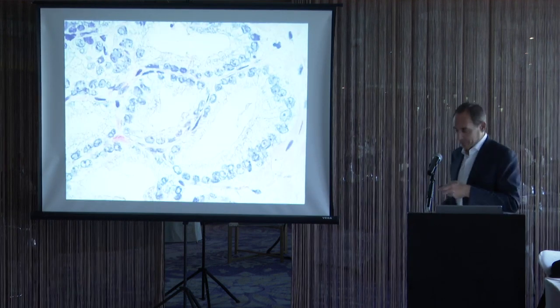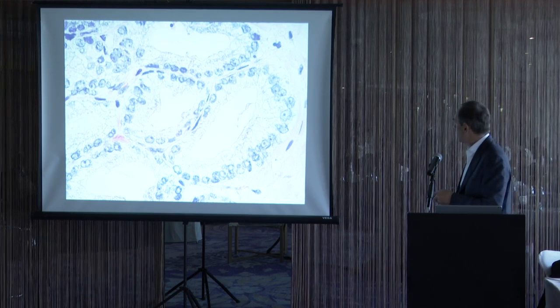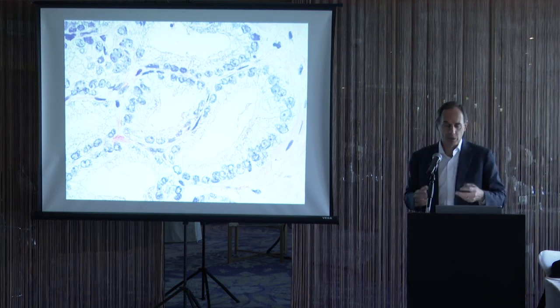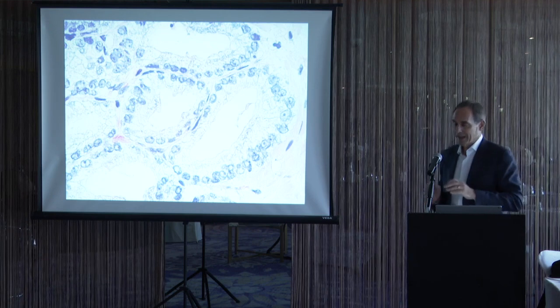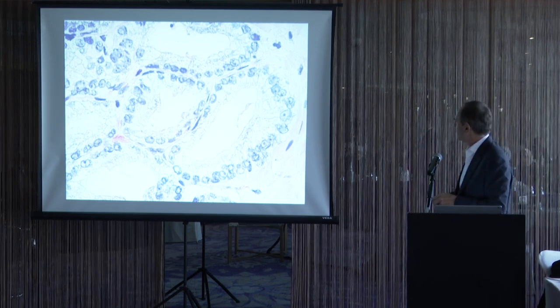The other feature that makes all pathologists more comfortable sometimes diagnosing cancer are prominent nucleoli. But there are mimickers of cancer that have just as prominent nucleoli as cancer. So it's, again, one feature out of several, but not by itself diagnostic.